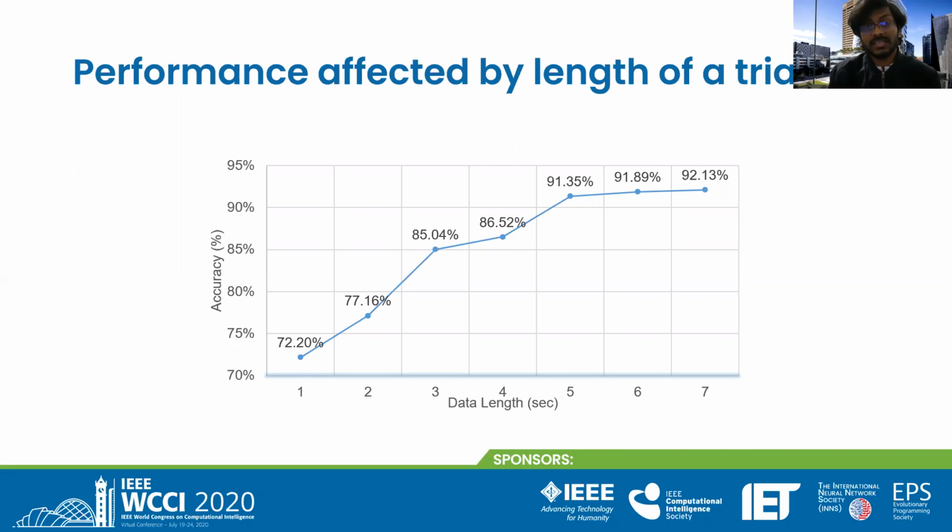If you see in this figure, as the data length, basically the trial length before you make a decision using CCA, gets larger, the accuracy gets better, going up to 92.13% to detect the right frequency focused on by the user to perform a certain action, right?